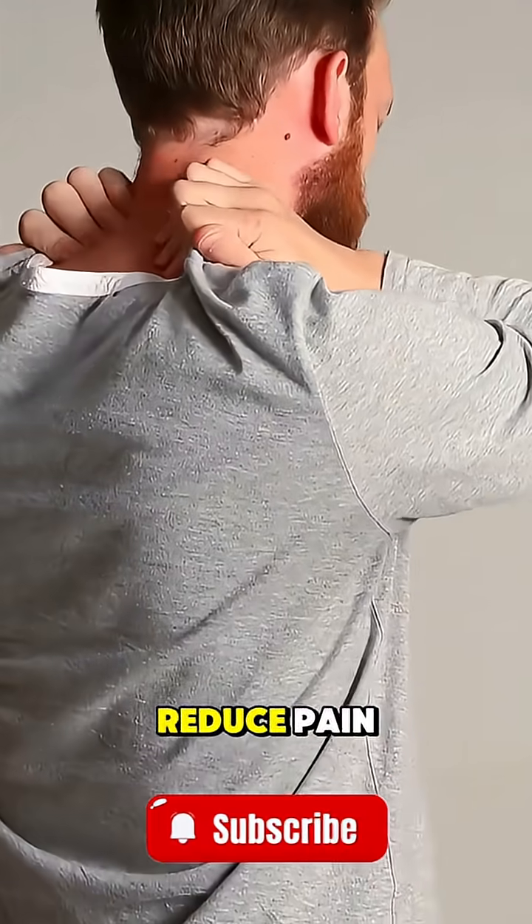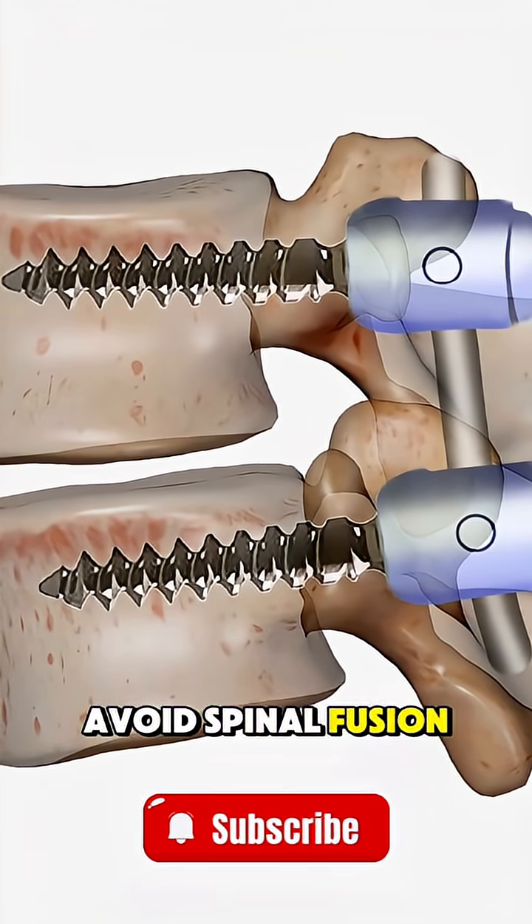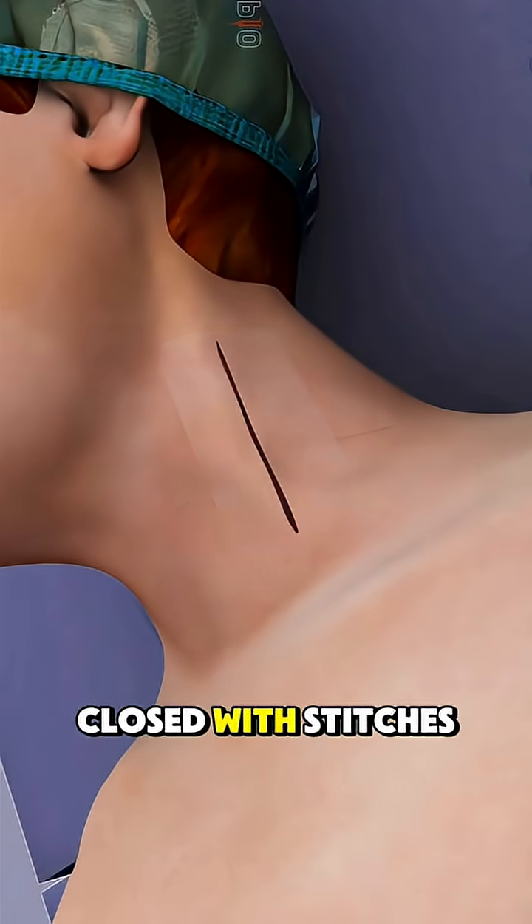The goal is to reduce pain, restore movement, and avoid spinal fusion. Once the new disc is in place, the cut is closed with stitches or glue.